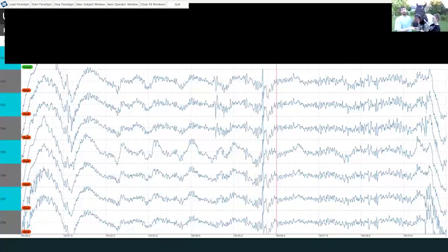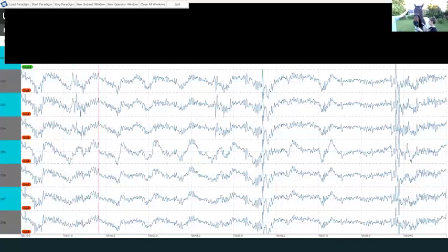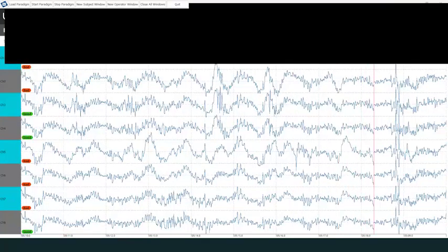So you most probably see more ear movement. When he's listening to different sounds, like I'm doing now, he moves the ear a lot, so you probably see that more now. Yeah, the ear muscles are closer.